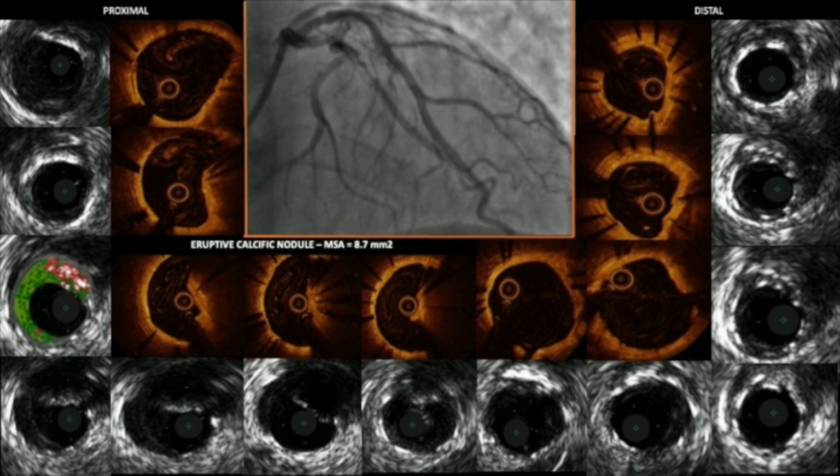So a very safe result, physiologically acceptable. It's a diffuse disease. The patient is doing great, is under single antiplatelet therapy with, I don't know if aspirin or clopidogrel, and this is the imaging you get inside the vessel. Outside, by angiography, it looks great, but this is what we get in. And I think this is the issue of our next discussion, Emanuele. If we have to do something, if we are happy with this uneven distribution of calcium and the asymmetric form of this D-shaped stent at 1 year of the procedure.